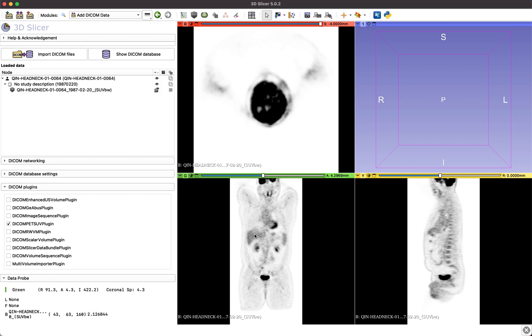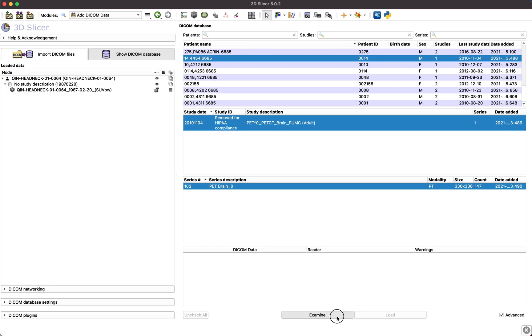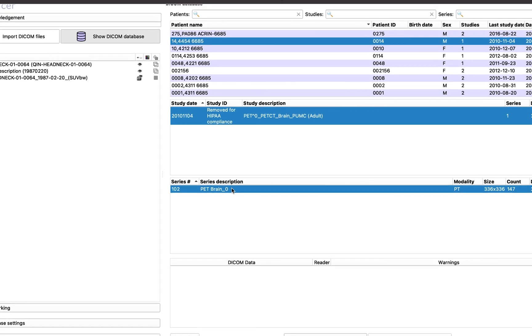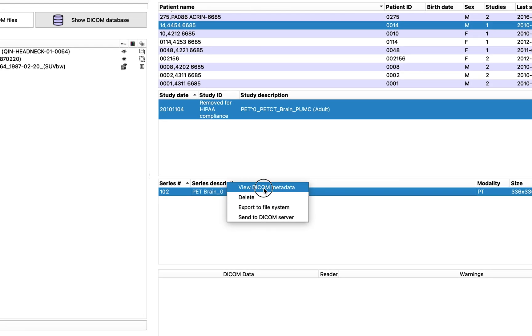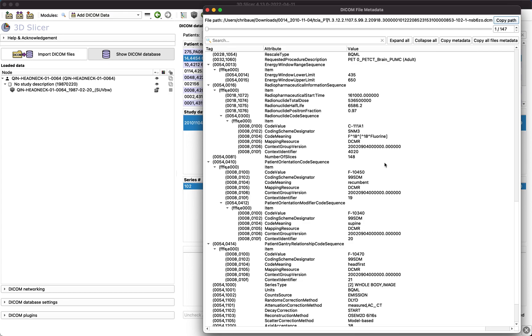This is a typical range for this type of PET tracer. Now that the scan is SUV normalized, the subject may be analyzed using a variety of quantitative tools. In case the plugin does not display any SUV normalization options for your PET scan, the reason is typically that not all required information is present in the DICOM header. One can check the DICOM tags by selecting View DICOM Metadata from the context menu and compare it to the list of required tags.